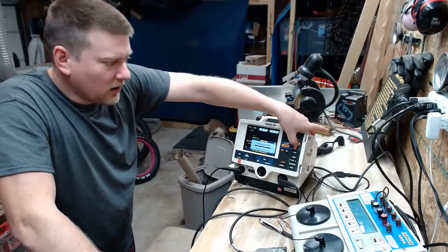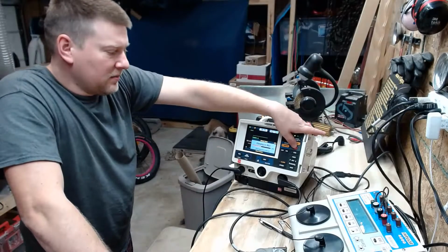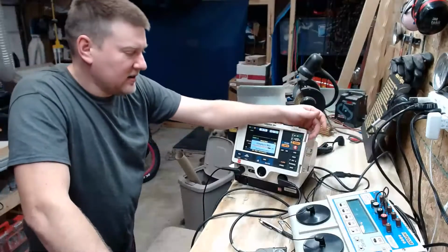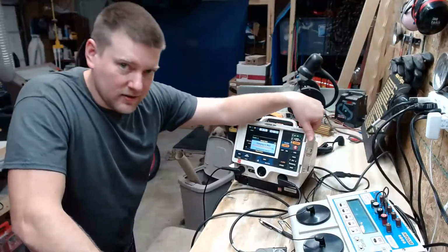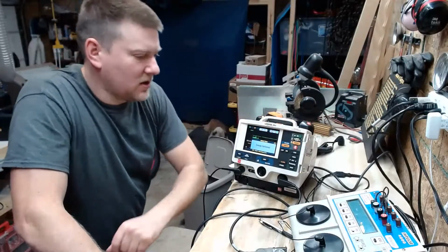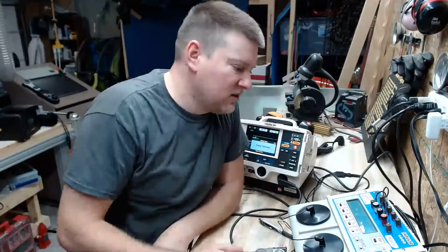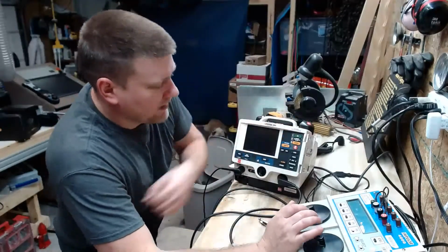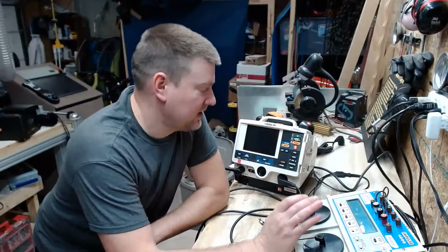I'm not going to run through all of them, but this is putting a drain on the battery, so we're testing the battery, and at the same time, we're making sure that the defib is consistent. Discharge. 3, 2, 1. 372 joules. So anyway, that is how you test that function.